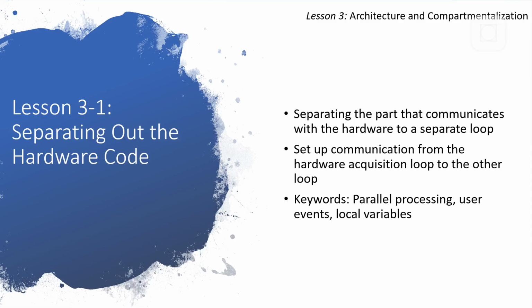This is lesson 3-1, separating out the hardware code. The focus of this lesson is to separate the hardware acquisition to its own loop. This is important because other parts of the application which are not relevant to the acquisition might halt the acquisition. To do this, we need to set up communication from the parallel hardware acquisition loop to the other loop. We will do this with something called a user event, and we'll also use a local variable.